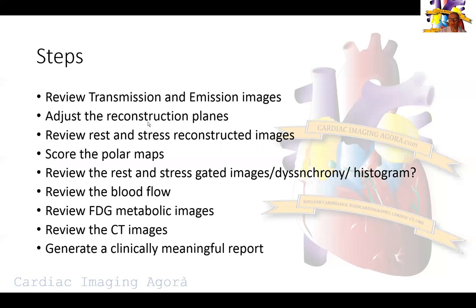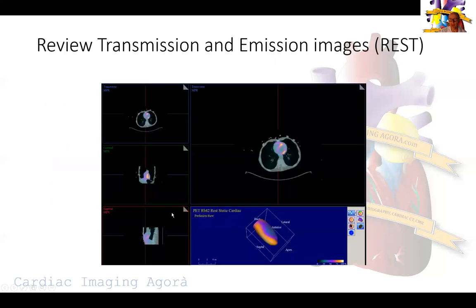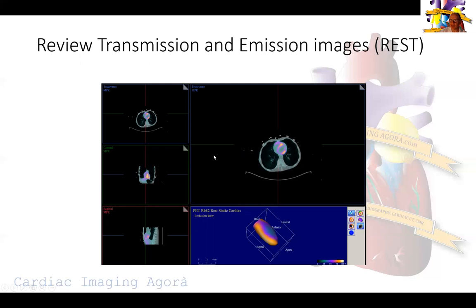We go through our step-by-step list of how we read this test. We start with the transmission images and work down step by step to generate a clinically meaningful report. This is a 63-year-old male — I usually like to read images independent of clinical history, though you're often not blinded to gender and age. This patient was referred for a rest, stress, and FDG PET — pharmacological PET.